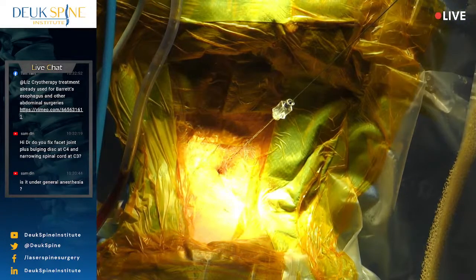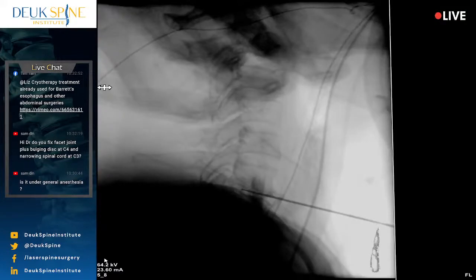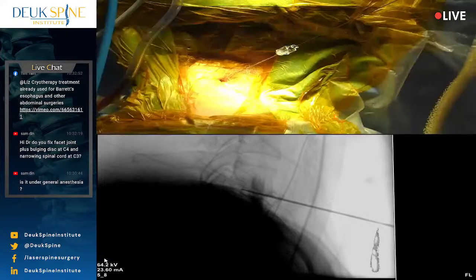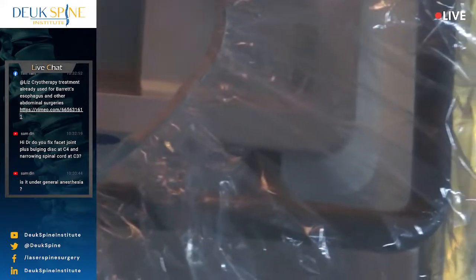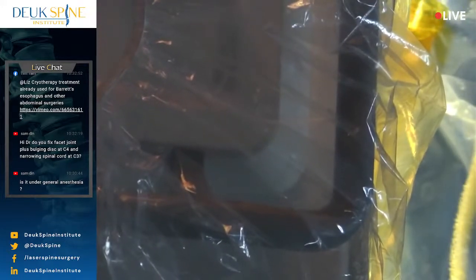All right. So I'm in as far as I can go safely with the guide wire. I've got almost a true lateral. Remember, you can be fooled by the scoliosis, so it's very important you get a true lateral, or you will not know how deep you are. Let's get an AP. Because if you don't have a true lateral and you're looking obliquely at the vertebral body and disc, you could actually be further back than you think you are.